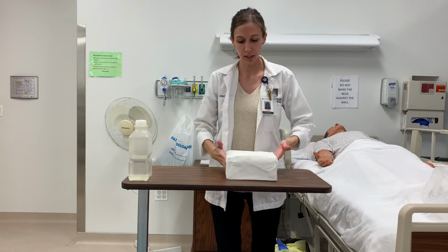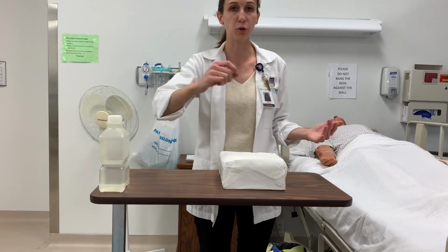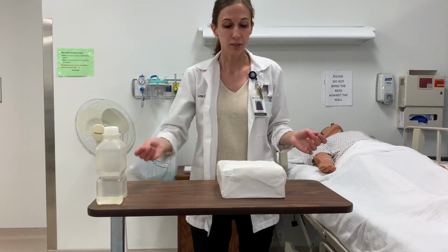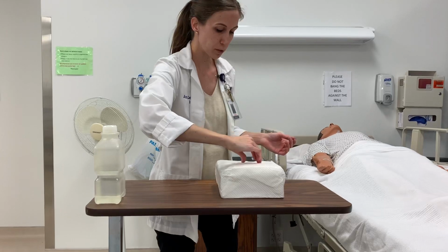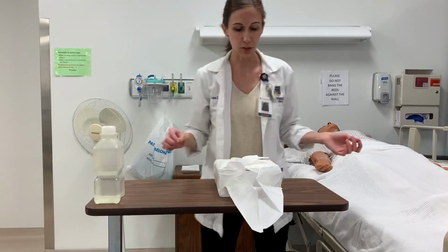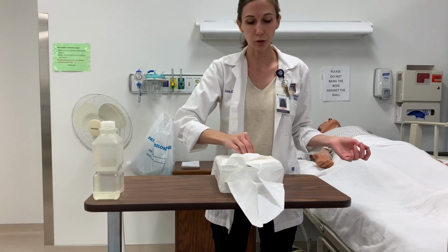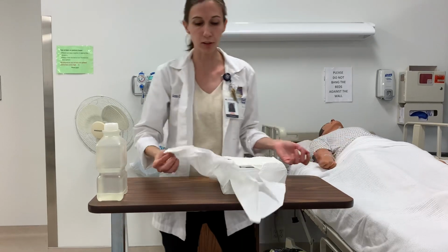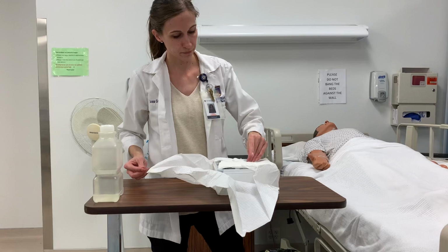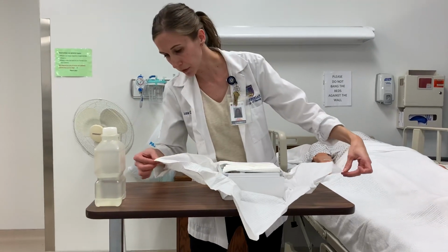So how these work, again, I am above the level of my waist. When opening the package, I am going to open away, then the side, and then closest to me. So I'm going to reach around the package to open the flap furthest from me. I'm going to do this side, and note that I'm using my right hand to open the right flap. I'm not crossing over in any way. And then I'm going to take this one to pinch. I need to keep this open.